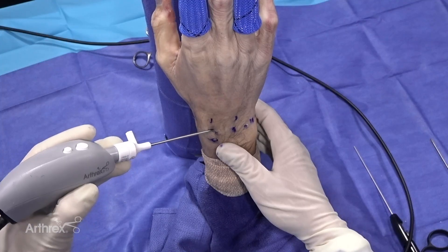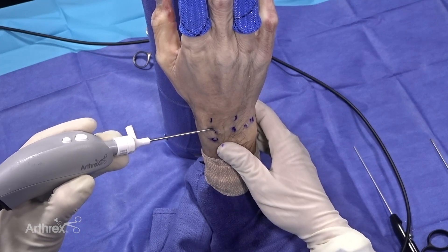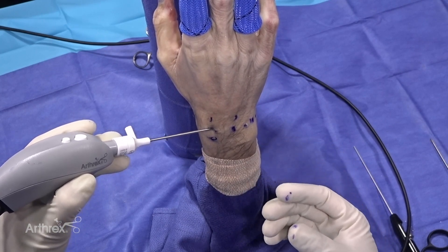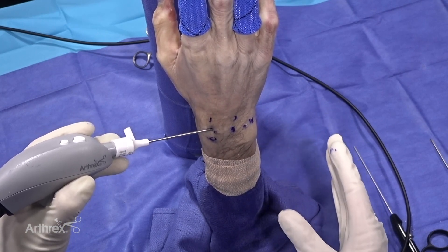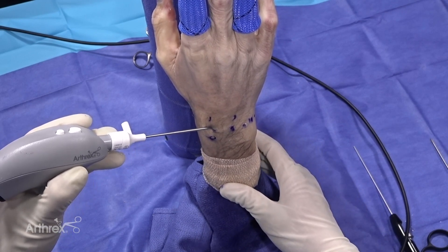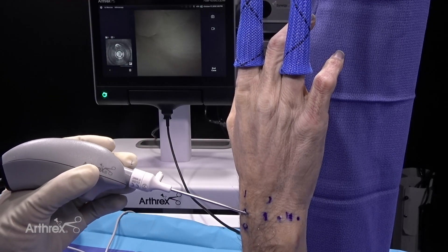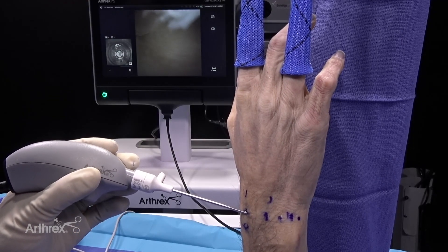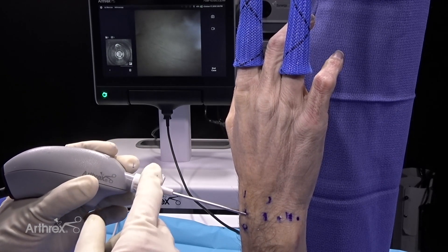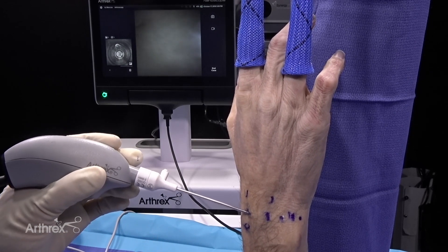One of the things we sometimes struggle with in arthroscopy is that our tools get in the way of each other. A huge advantage of the nanoscope is the ability to make fine adjustments as you're working through the other working portals. In this cadaveric specimen the visualization is not optimum, but one advantage of the nanoscope is I can have my assistant inject just a little fluid to improve visualization.